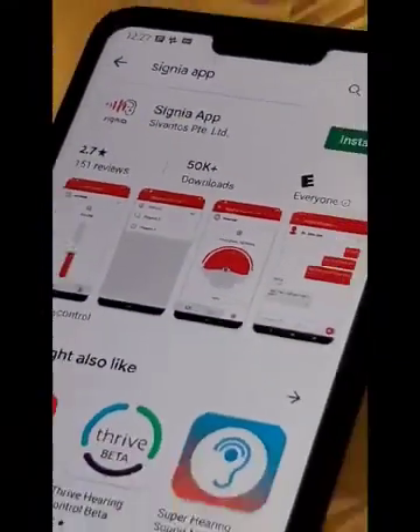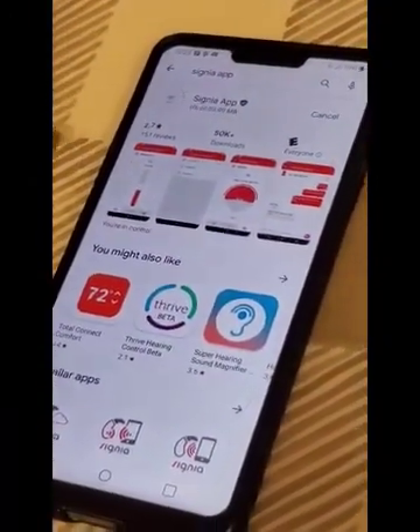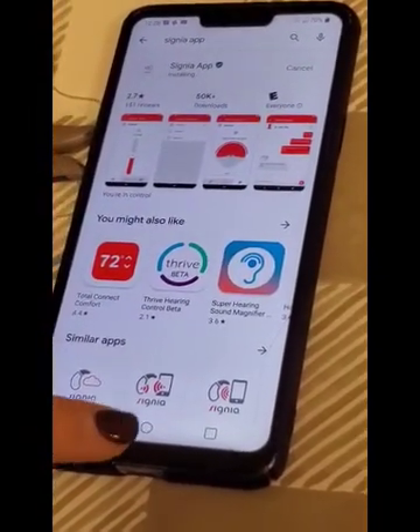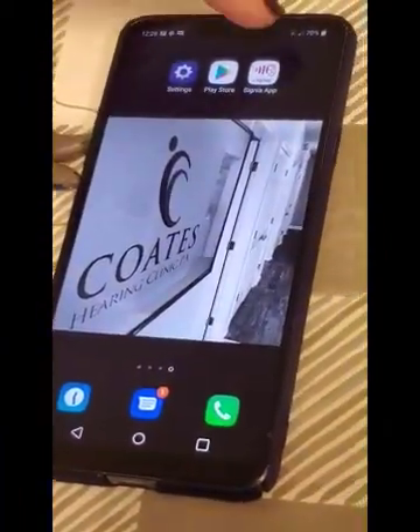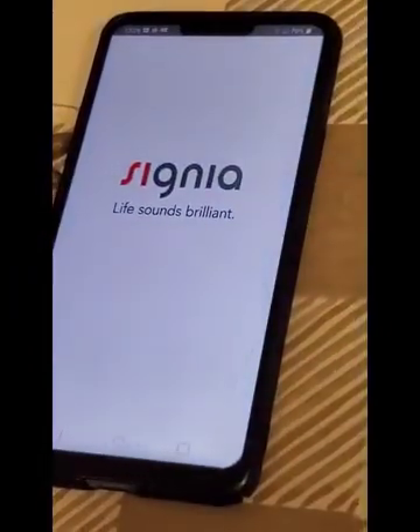We're going to go ahead and hit Install. It's a free app. It just takes a minute to download. Once it pops up here, you're going to open it up to connect it and walk through the steps.